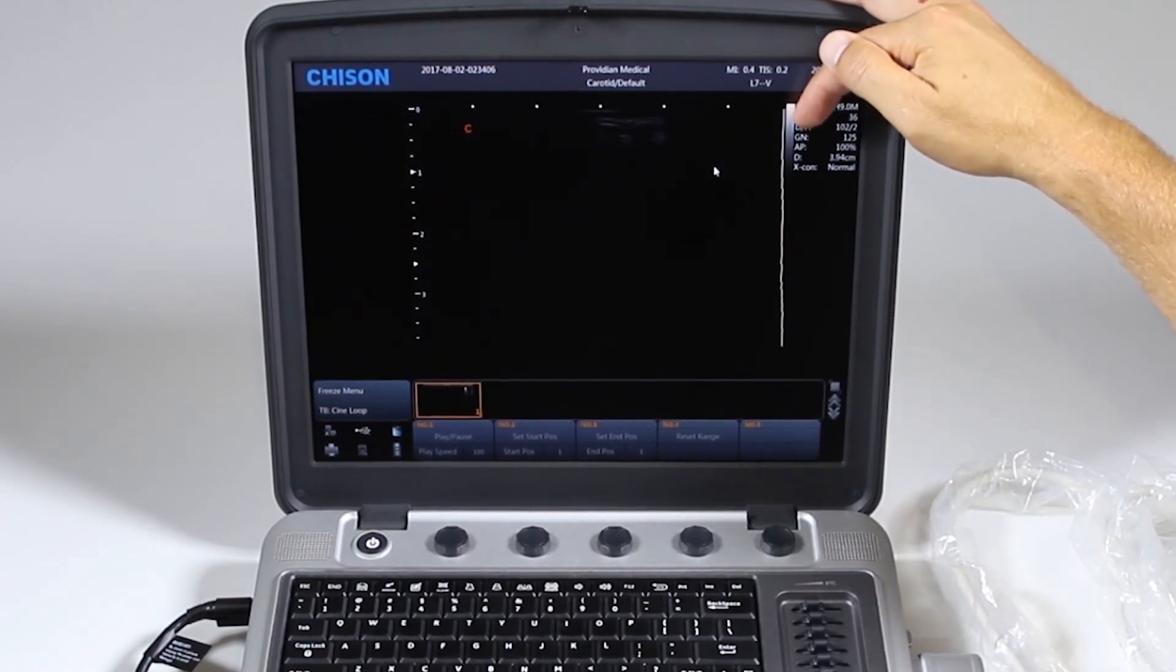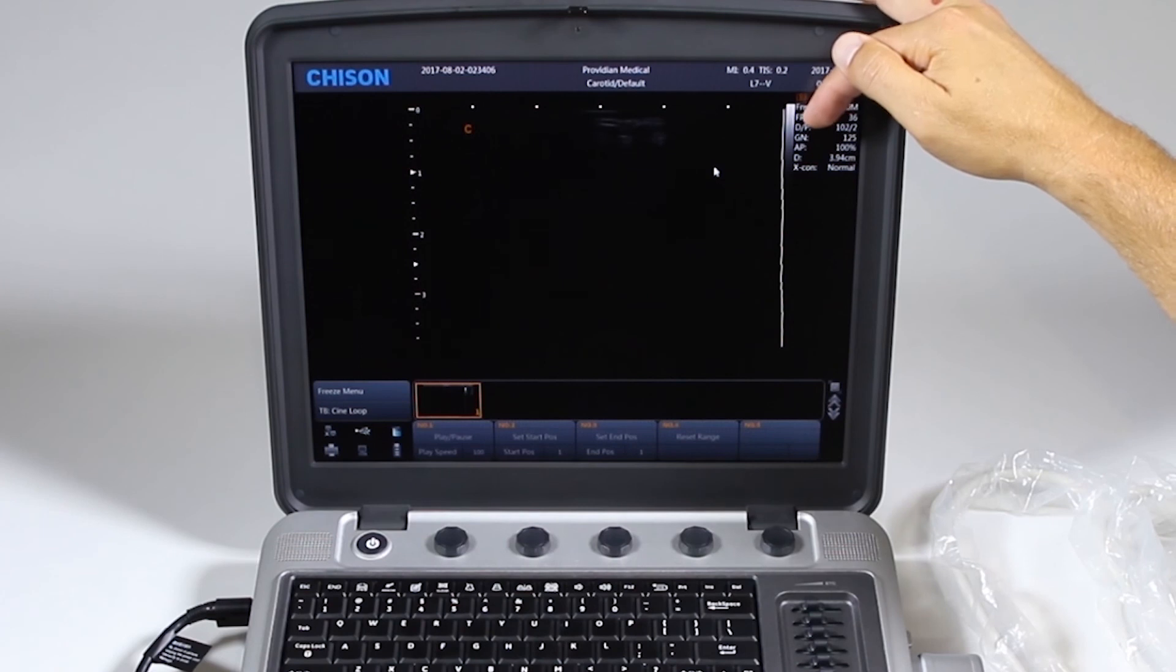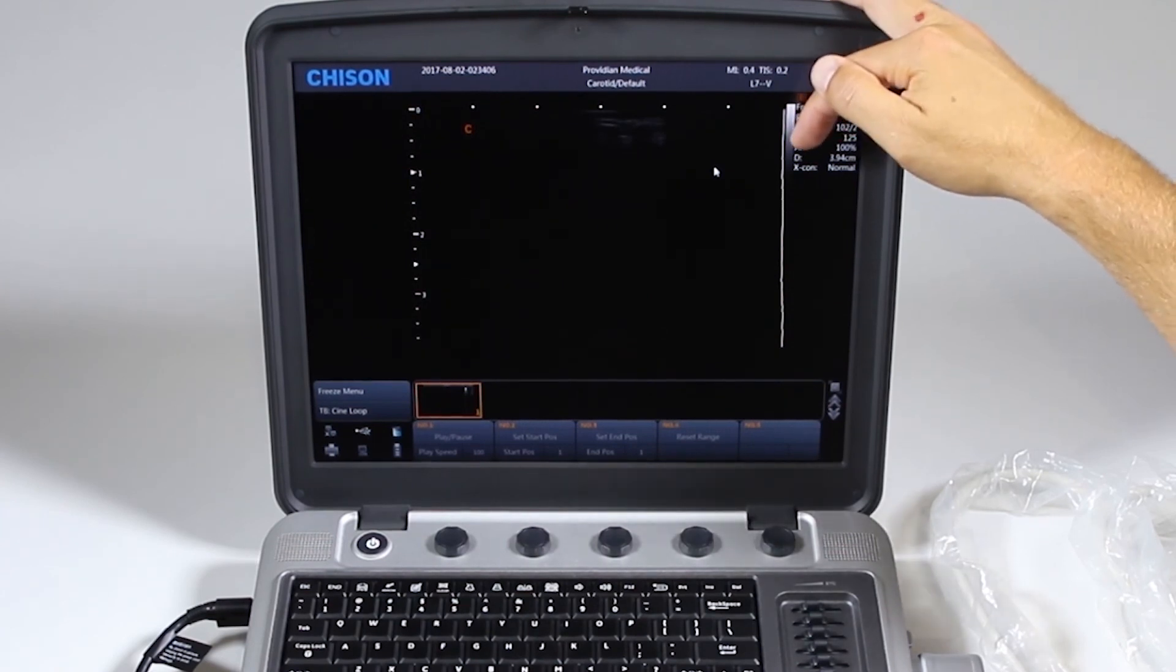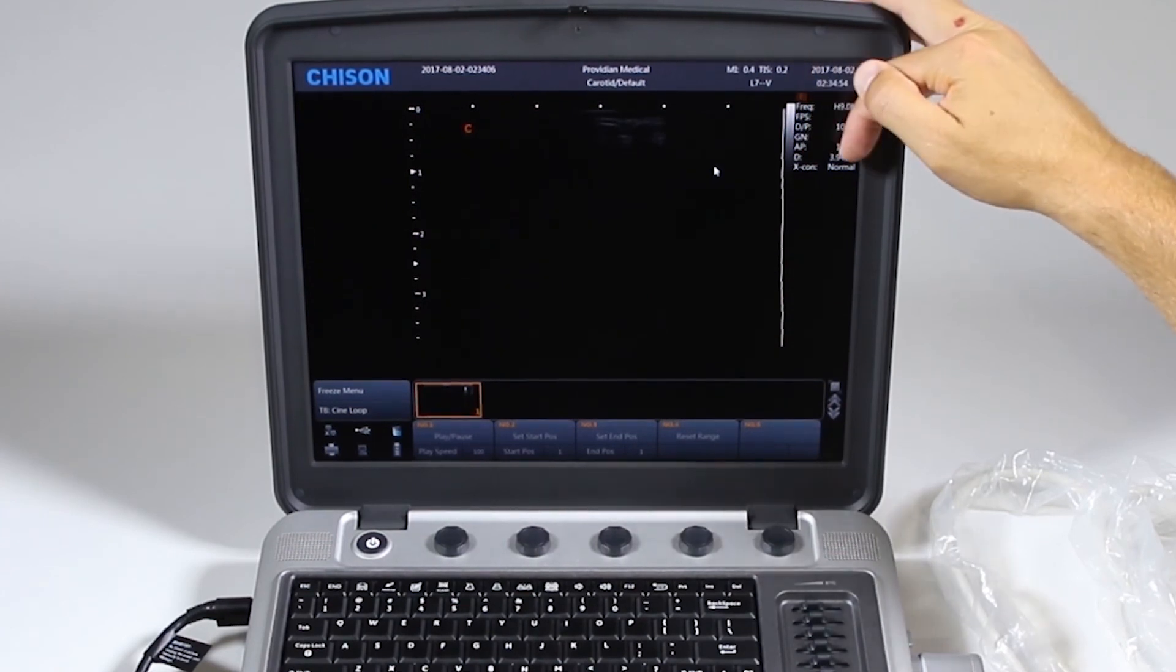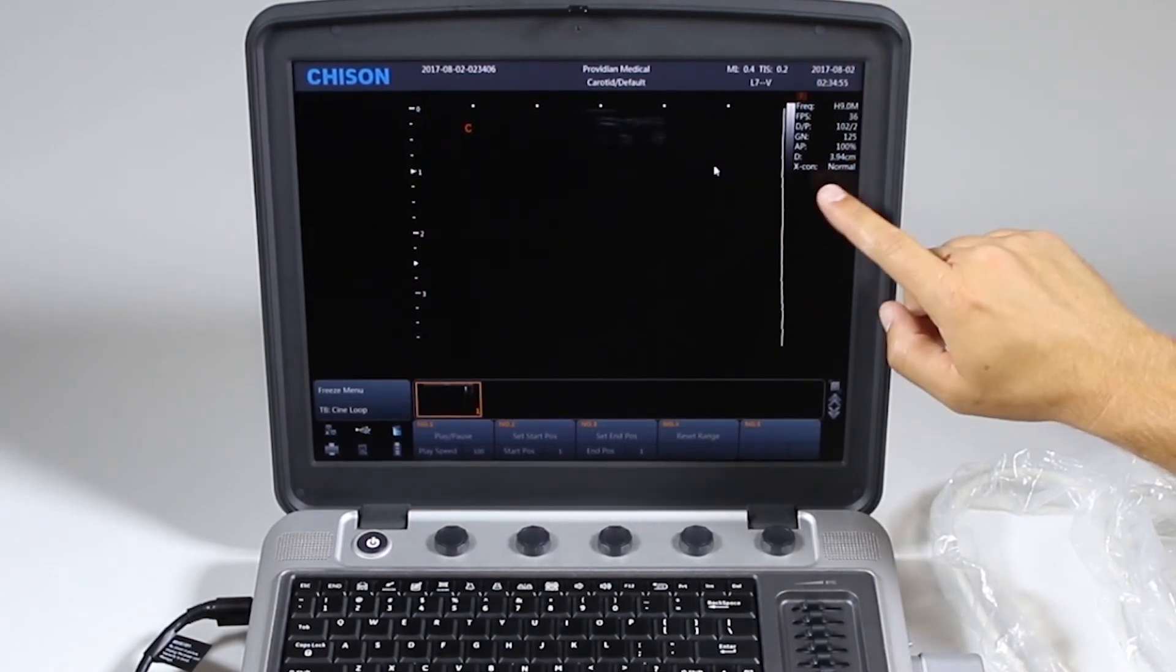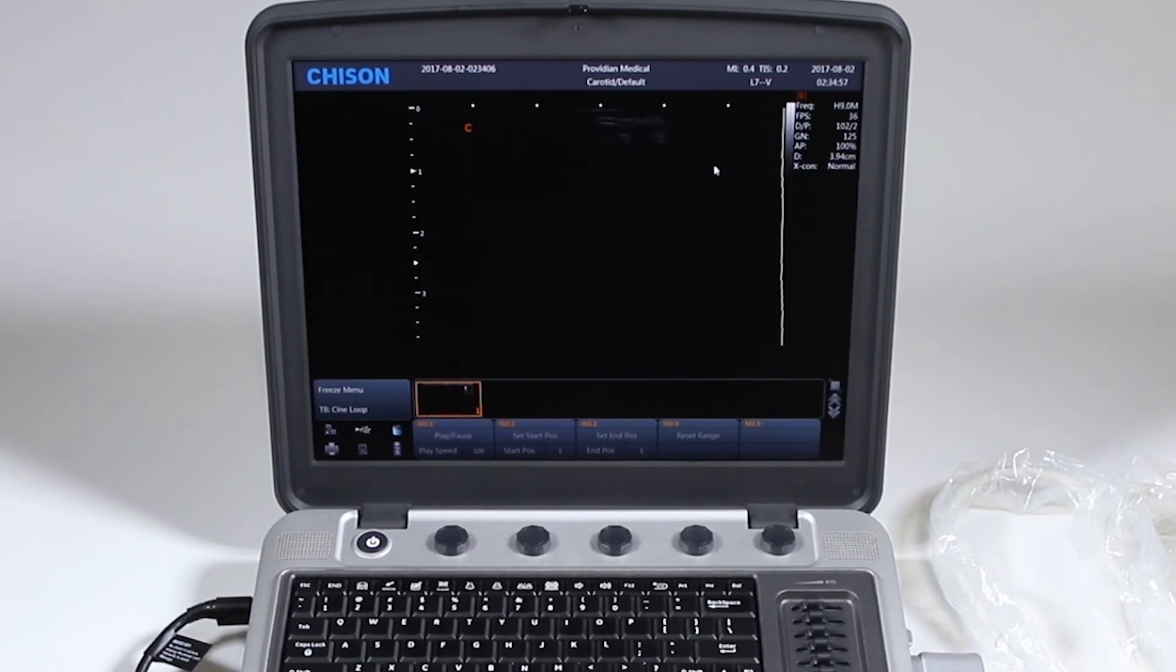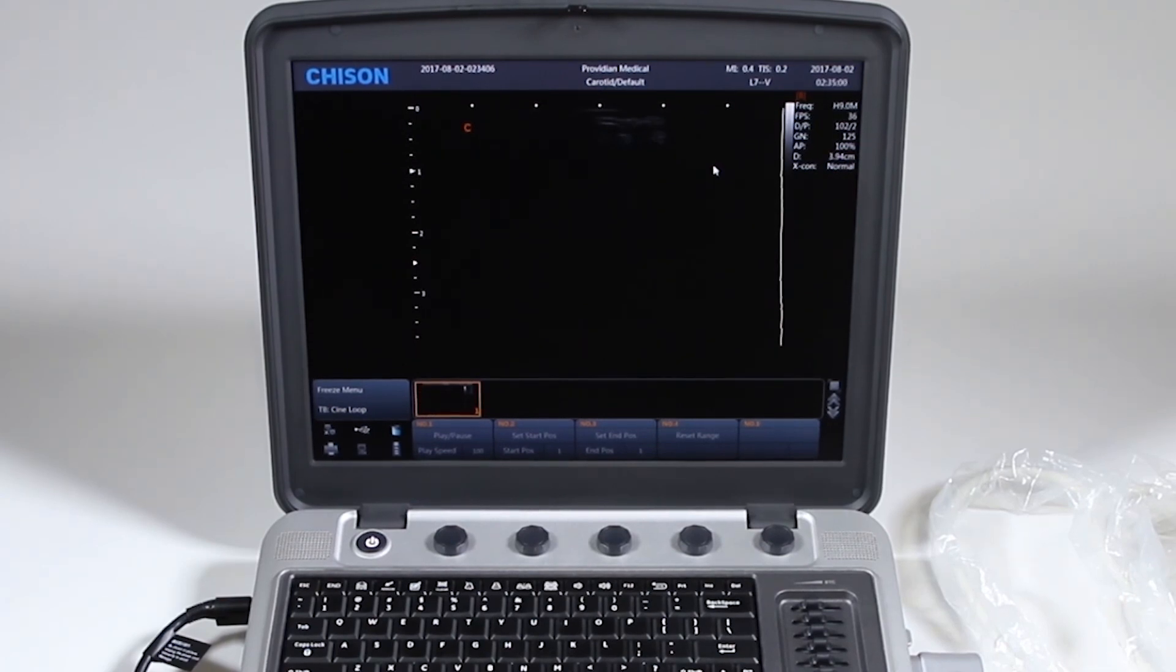Dynamic range and persistence. Gain. Acoustic power. The depth. And what your setting is for your X contrast. And next, we'll get into imaging and image optimization with the Chison Sonobook 9.